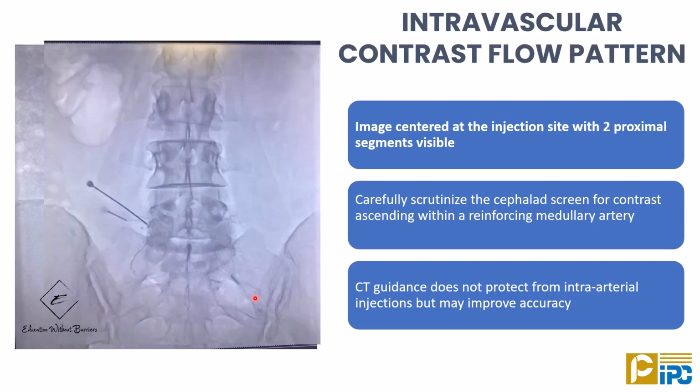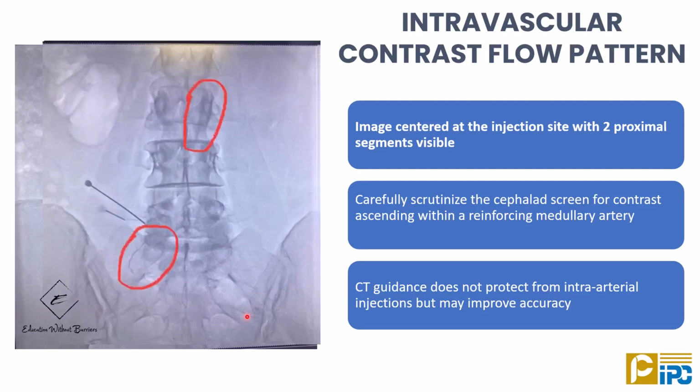So let's look at this. This is the pre-contrast image. Now I've given the contrast. And can you see the spread over here? If you weren't looking with a fine eye, you might not have seen. There is something which has come up over here as well, which wasn't there in the image before. So that's how minute it can be, and that's how closely you have to look at the images.